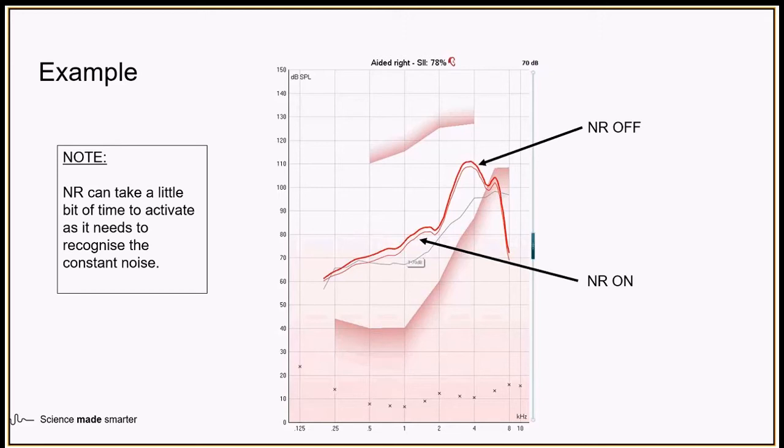Speech is very specialized in that way, where it has a certain spectral form and speed and how fast it's changing, compared to a constantly spinning fan, which could be seen as static. It would still play all frequencies, but at a more controlled rate. So the hearing aid could give amplification focus on the more dynamic signal, in this case speech, and give less of an amplification focus for the static noise, which is why you may see this.